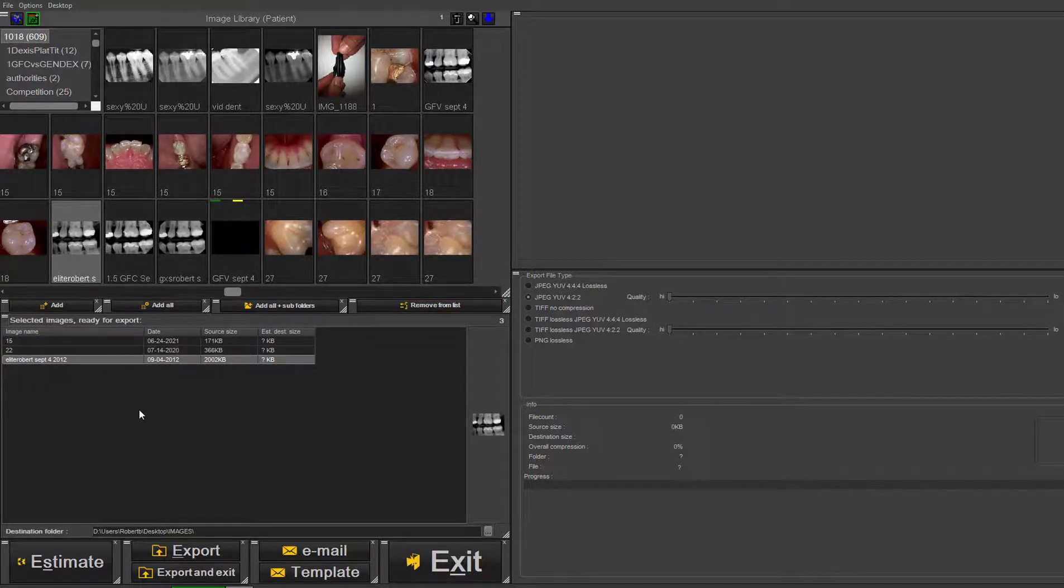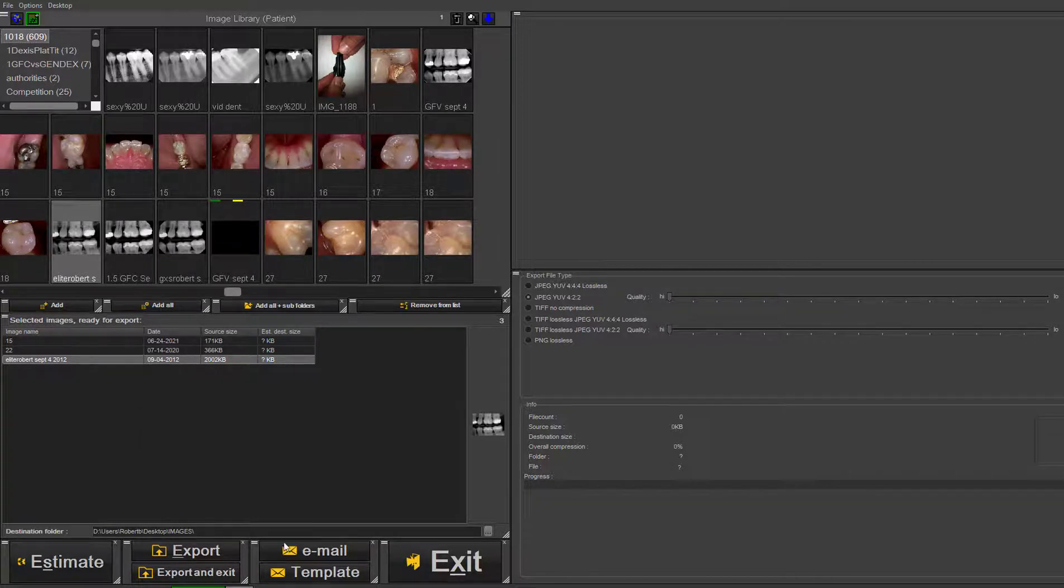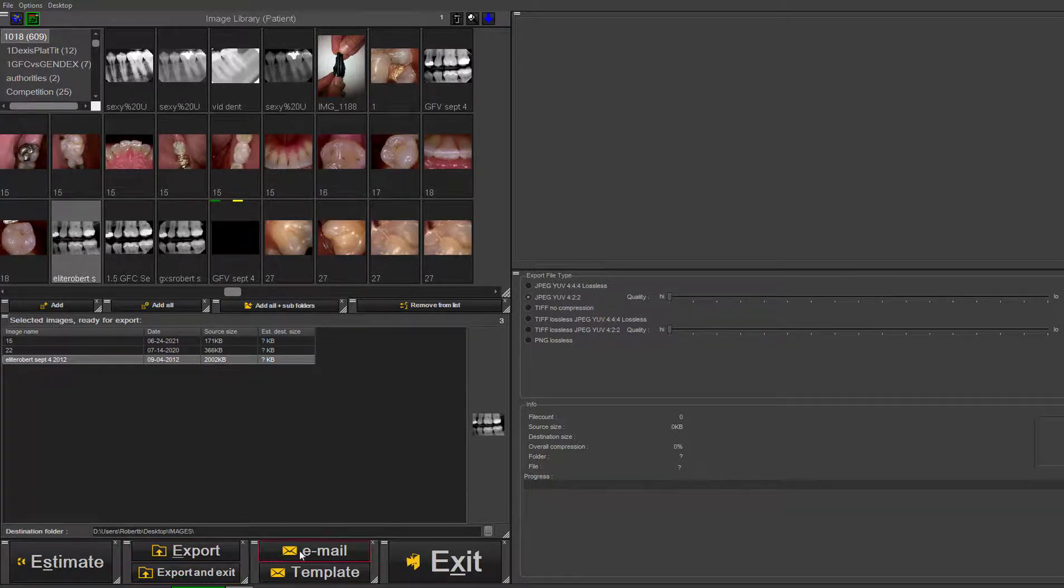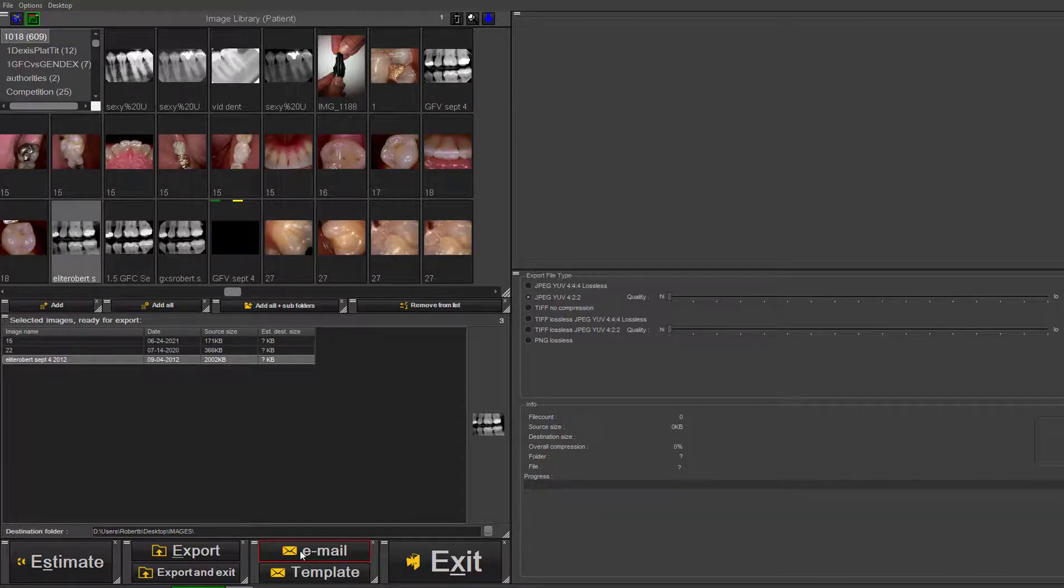If you want to execute the export, all you do is click on 'Export'. You can 'Export and Exit', which will shut down the export window. Once it's done, you can attach it to an email directly or create a template.